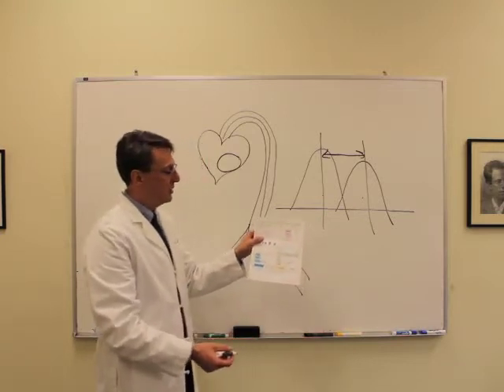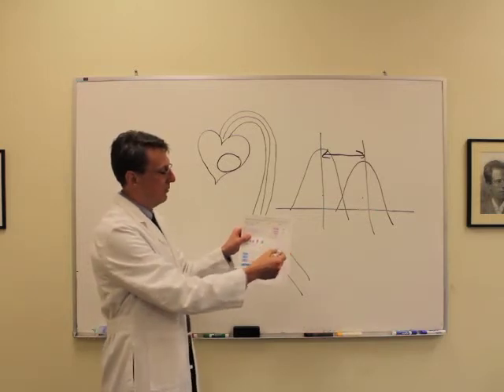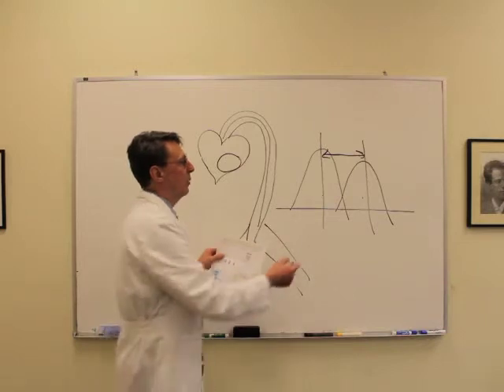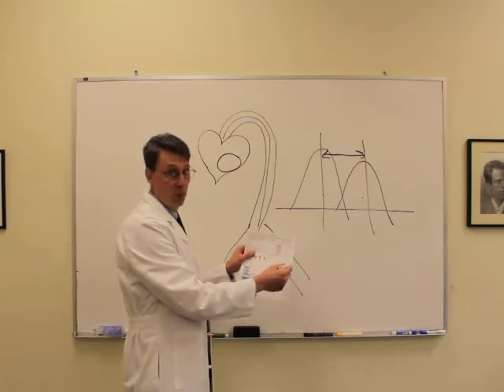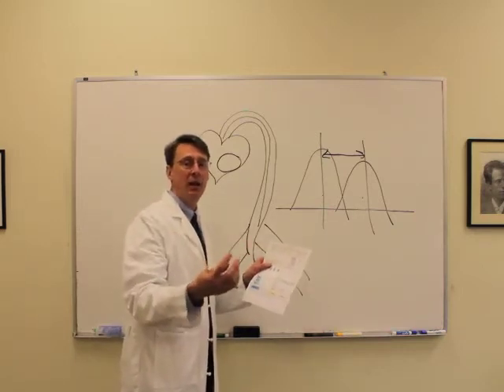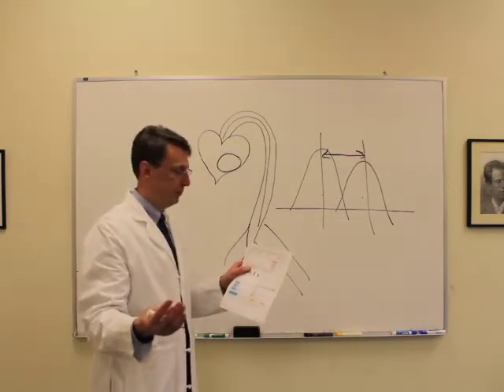The first thing that we can see from the report is a picture of your accelerated waveform. So this waveform, through calculus, can be converted into a different waveform that makes it easier for us to analyze different components of cardiovascular function.